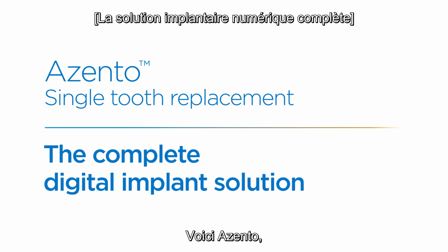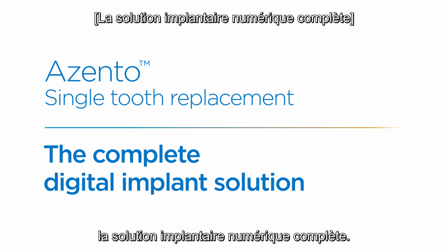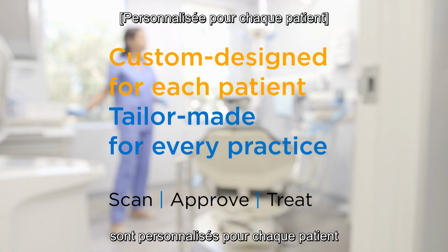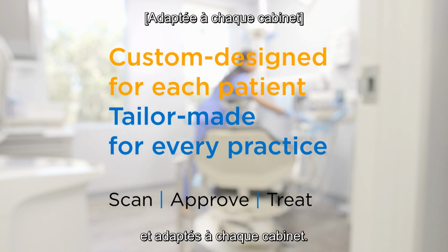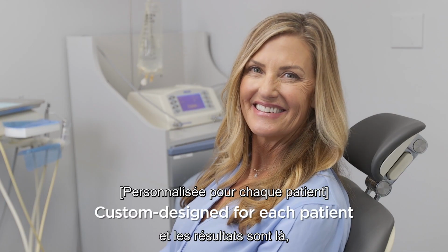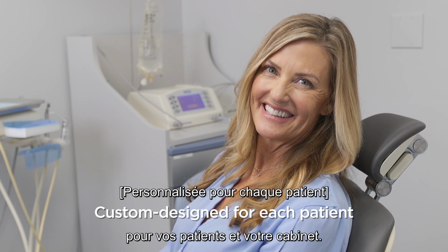Welcome to Azento, the complete digital implant solution. With Azento, implant treatments are custom designed for each patient and tailor-made for every practice, enabling efficient, consistently excellent results for your patients and your practice.